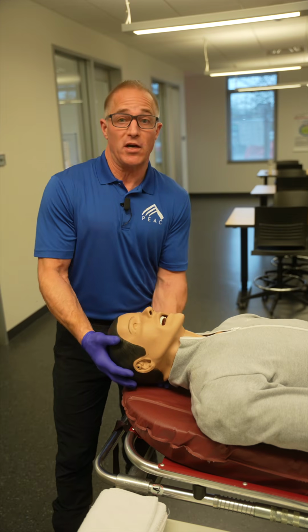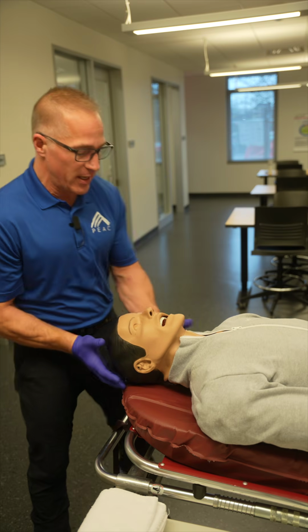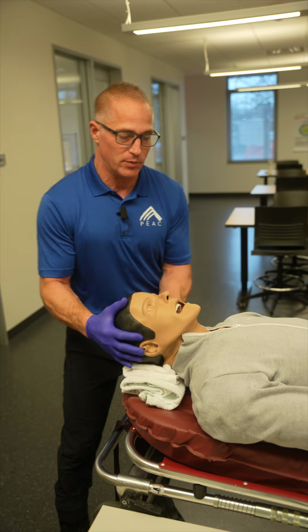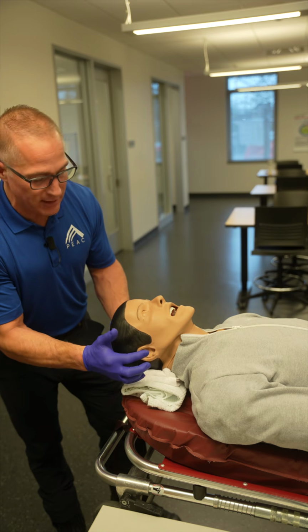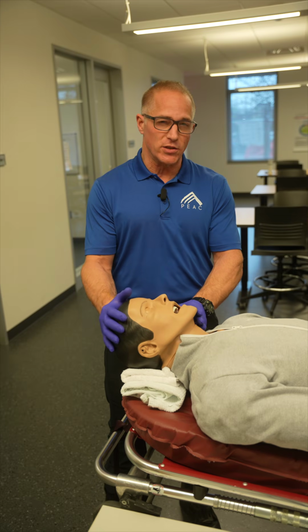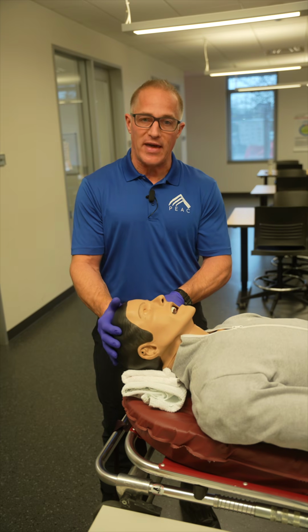You can do this yourself by simply lifting the patient's head, having a partner lift the patient's head, or placing towels underneath the patient's head to achieve a perfect flextension position. Clearly I can see with two towels, it perfectly aligns the patient's ear hole with the sternal notch. The advantage of flextension is it significantly increases our first pass success as well as has benefits for ventilating your patient.